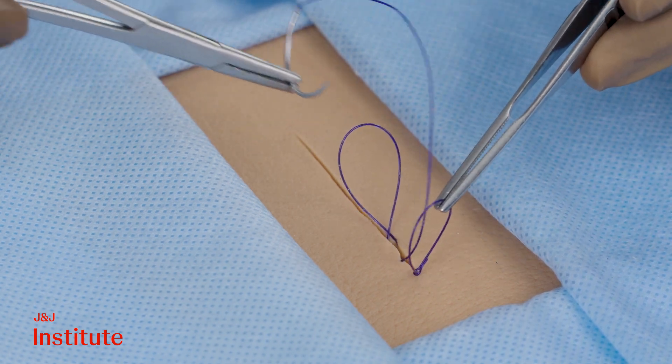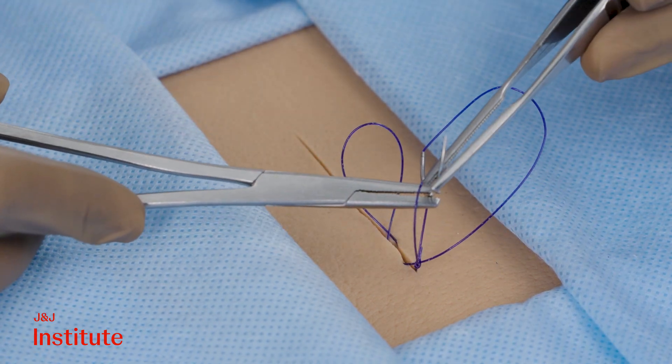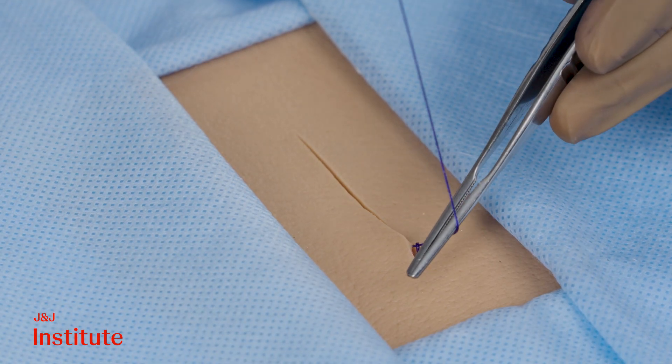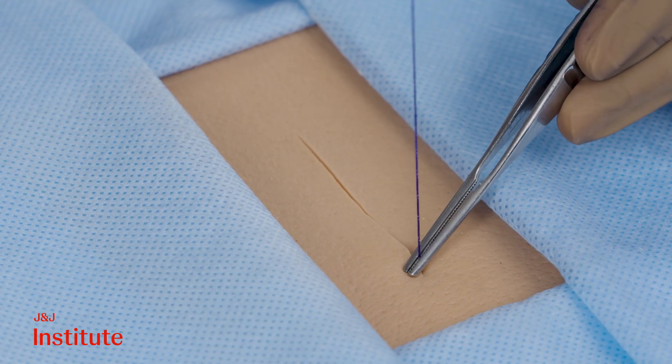Instead of tying a knot, the needle is threaded through the preformed loop and the suture is pulled to anchor the closure.